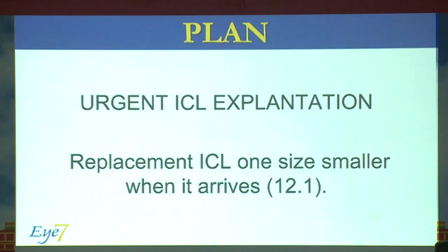Replace it by one size lower. But now it takes time to get the same lens one size lower. So we monitored, and when it arrived, we decided that we are not going to take it out first and wait for 2 weeks and then do the other one. We said, let's monitor. If we land up into a raised IOP, we'll manage accordingly, but we'll do it in one setting.